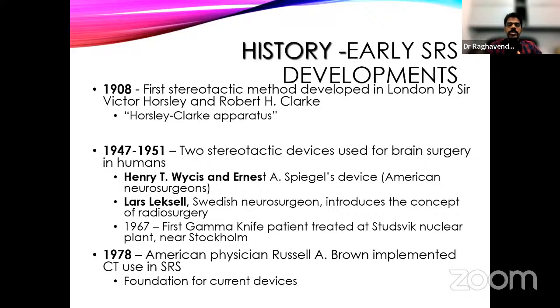From 1947 to 1951, two stereotactic devices were used for brain surgery in humans. One was by Henry T. Wycis and Ernest A. Spiegel, who designed a stereotactic frame that can be fixed on the skull. Similarly, Lars Leksell, a name we are all very familiar with, a Swedish neurosurgeon, introduced the concept of radiosurgery.